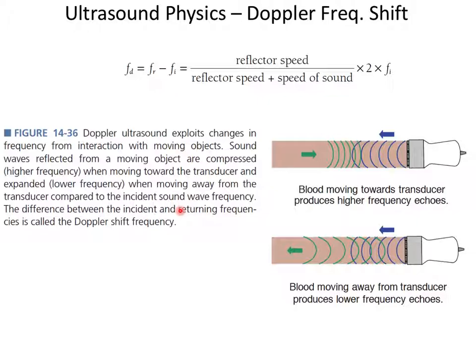And if the surface is coming towards me, the frequency upshifts, so I get a higher frequency received. So looking at the shift in the frequency, which is a pretty simple thing to do electronically, it's been done forever, you can measure the relative velocity at the instant that that echo occurred, right?